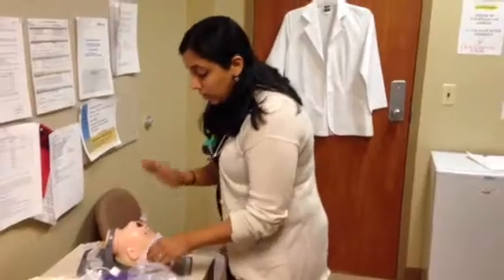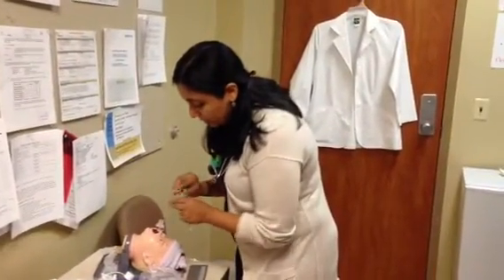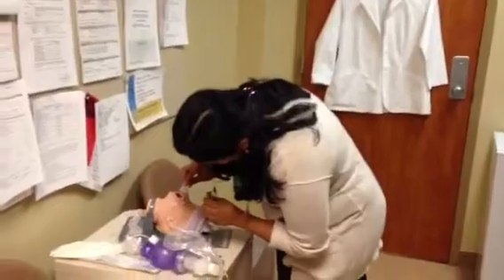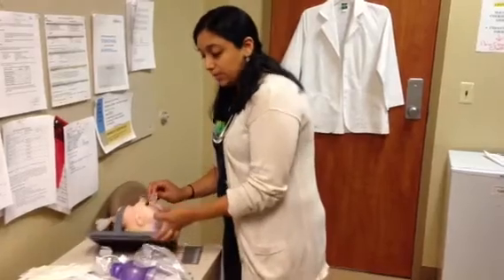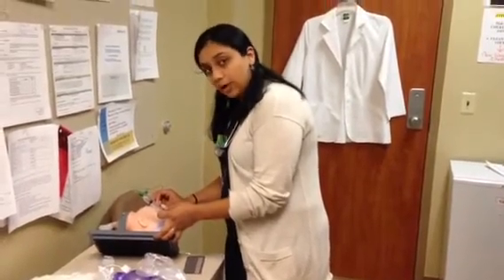Once that's done, you're going to reinsert the NG tube. You can lay the infant flat for that again. Reinsert the NG tube to the same marking. So again, 9 centimeters at the lip. Hold it in place. Again, that second person will push the rest of the surfactant, but now the infant's going to be in the opposite direction. You're going to be left side up so that the surfactant can naturally flow to the opposite lung.